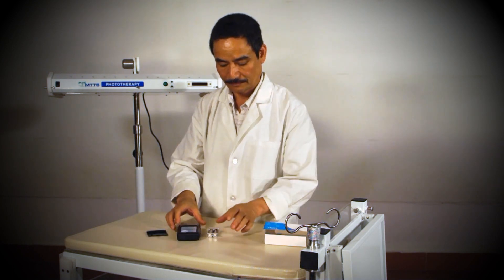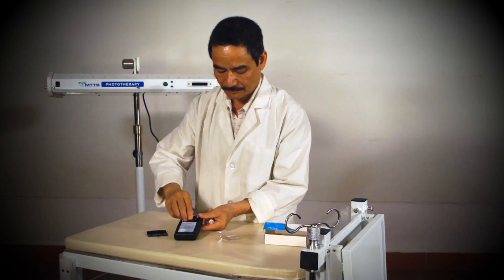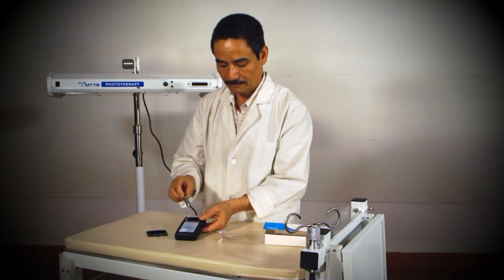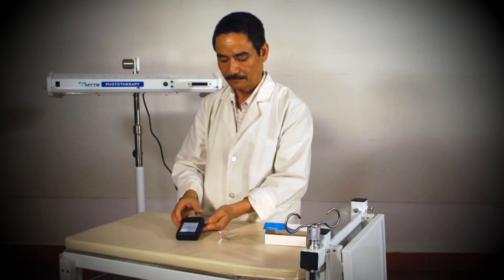According to the American Academy of Pediatrics guidelines, the correct wavelength for the optimal phototherapy treatment is 460 nanometers, and this light meter measures the light intensity at exactly this spectrum.